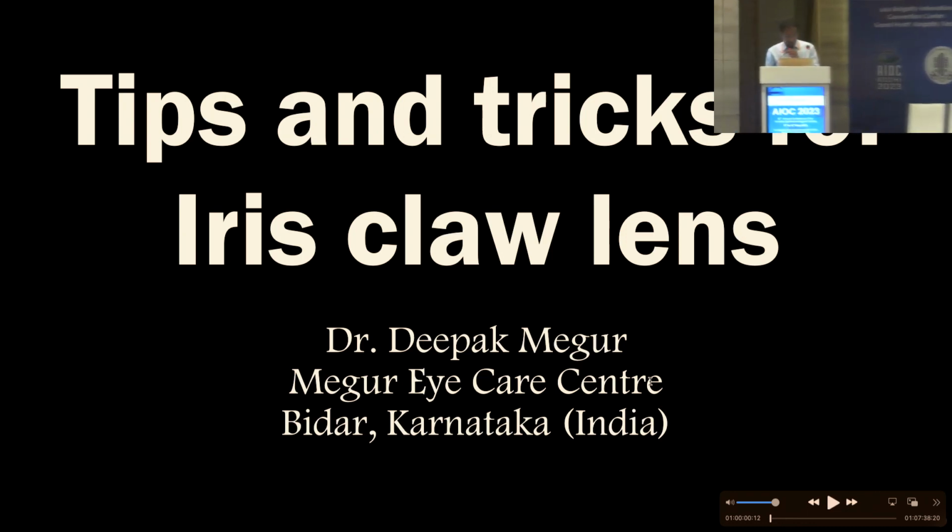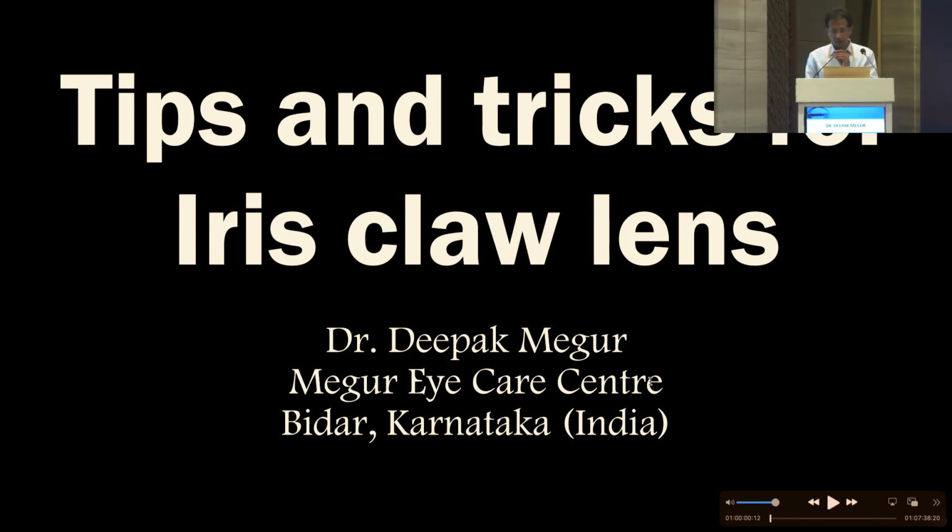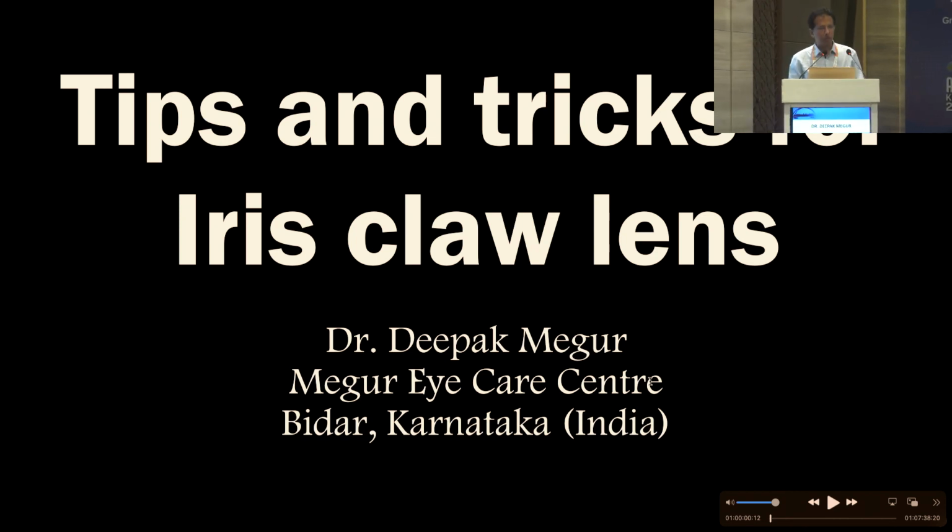Good morning, friends. Thank you, Mathur sir, for this opportunity. It's a pleasure to be in your session. I'll be speaking of something which is much simpler than any other options which we have for secondary IOL implantation. And these techniques can be employed by most cataract surgeons.